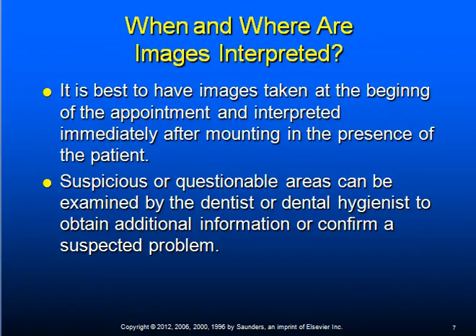It is best to have images taken at the beginning of the appointment and interpreted immediately after mounting in the presence of the patient. Suspicious or questionable areas can be examined by the dentist or dental hygienist to obtain additional information or confirm a suspected problem. It is important to remember that images are taken to benefit the treatment of the patient.